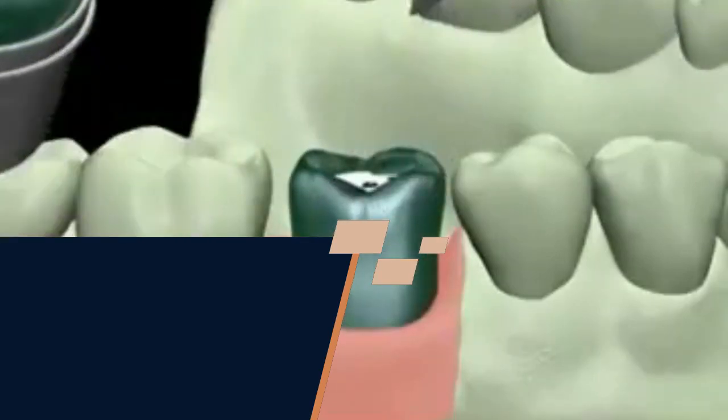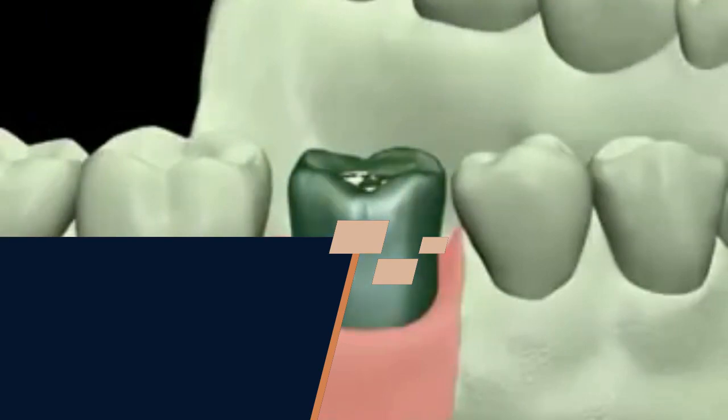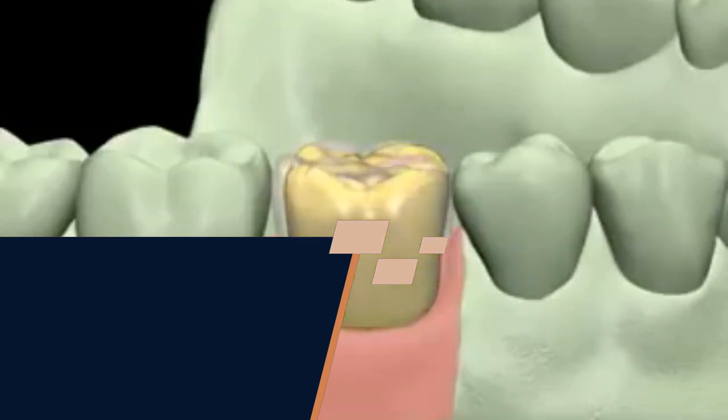Osseointegration. Over a period of several weeks to a few months, the implant undergoes a process called osseointegration, during which it fuses with the surrounding jawbone. This provides a strong and stable foundation for the prosthetic tooth.